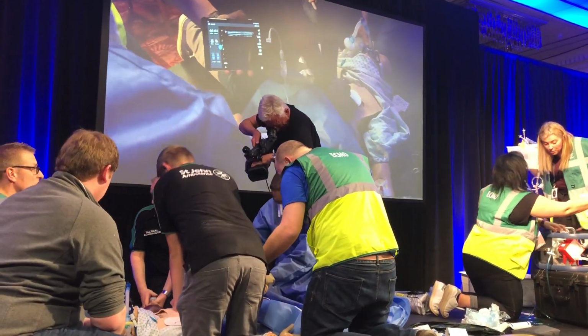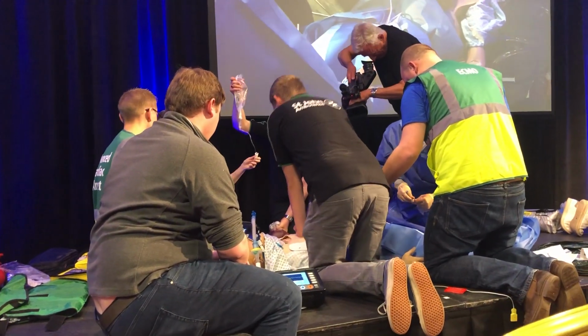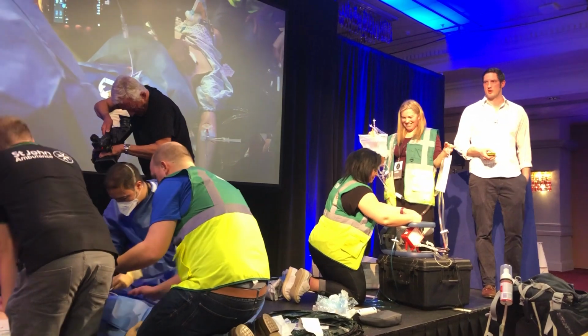Perfusion is setting up the kind of the Apple map of the ECMO world, the cardiac health. So they've got a circuit that they're priming and getting ready, which is going to be the circulation of this patient if indeed they do hit criteria.